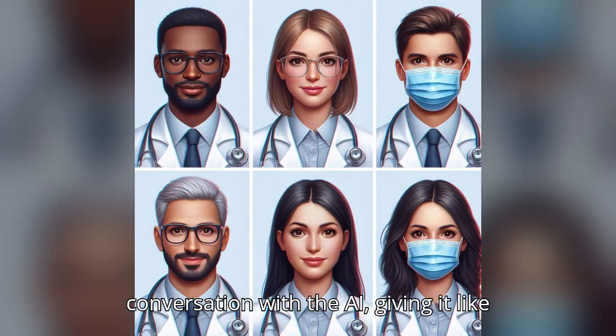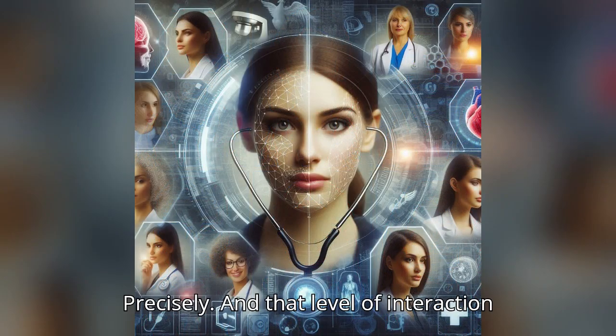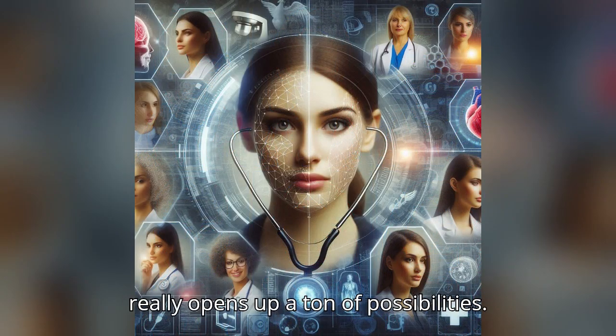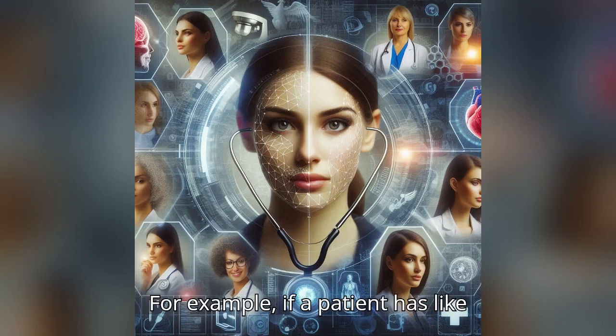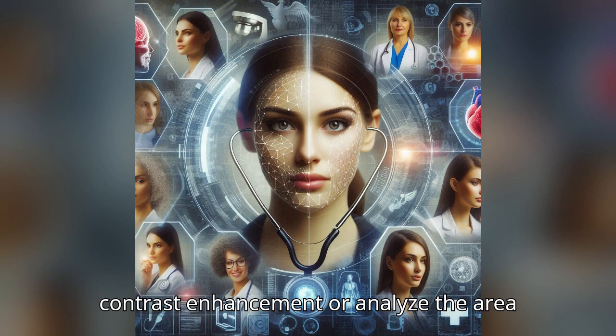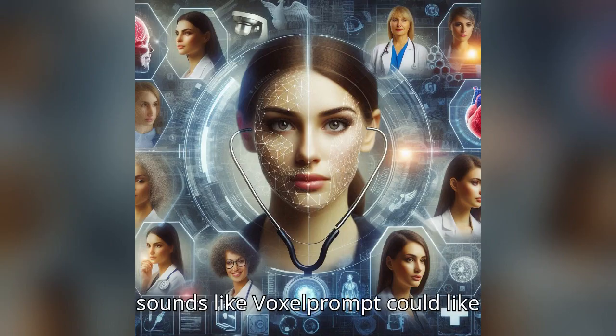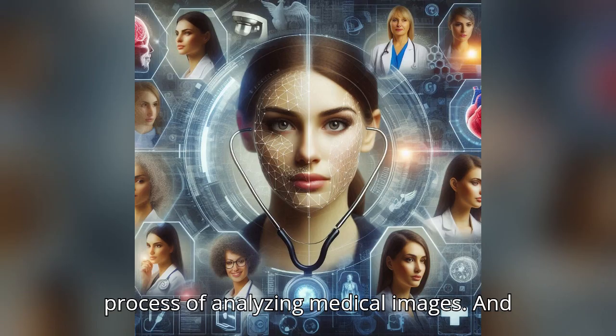So it's almost like having a conversation with the AI, giving it specific instructions using the nuance and precision of human language. Precisely. And that level of interaction really opens up a ton of possibilities. For example, if a patient has multiple lesions or abnormalities, a doctor could ask Voxel Prompt to segment only the lesions that show contrast enhancement or analyze the area of edema surrounding this specific lesion. That's incredible. It sounds like Voxel Prompt could significantly streamline the entire process of analyzing medical images.